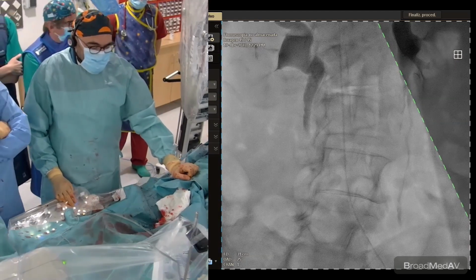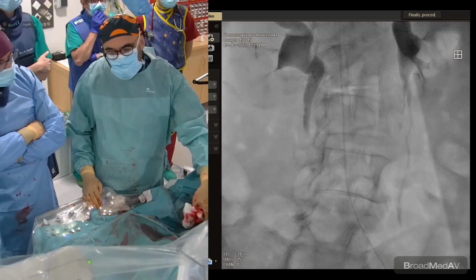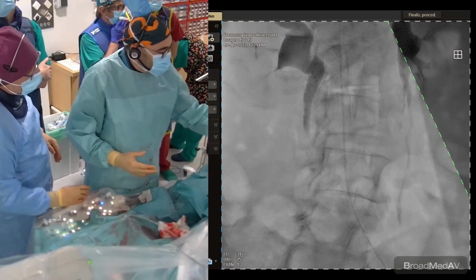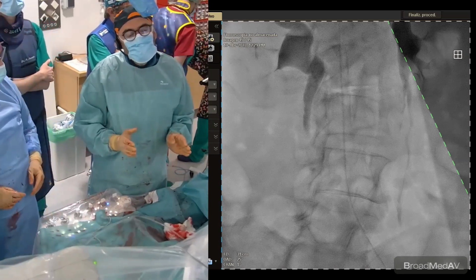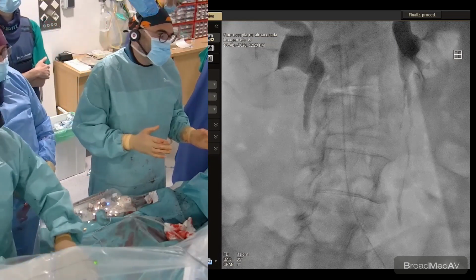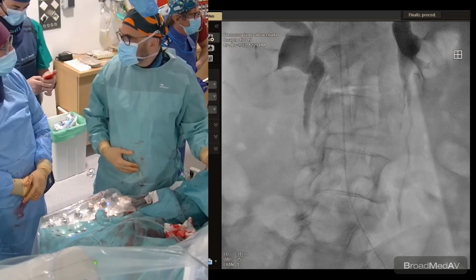The rate of pacemaker with this valve is similar to the Sapien. In fact, there is some study, of course non-randomized, that showed a slightly lower rate of pacemaker with this valve in comparison with the Sapien. The explanation of the authors was that having intermediate sizes, you can use the most exact size for each patient, and this theoretically could reduce the incidence of pacemaker and also the incidence of annulus rupture. We don't know, but this is a theory, but it could be.